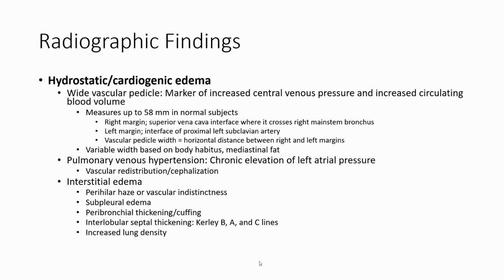In radiograph, in case of hydrostatic cardiogenic edema, we can find the vascular pedicle, a marker of increased central venous pressure and increased circulating blood volume, measuring up to 58 mm in a normal subject.